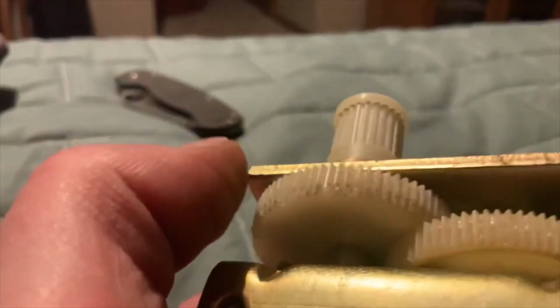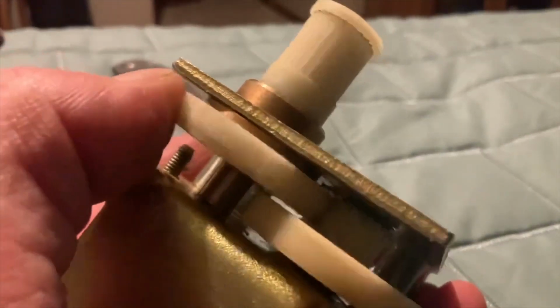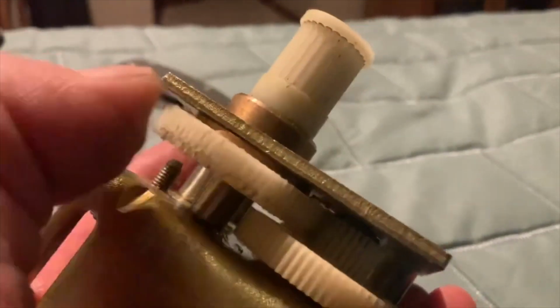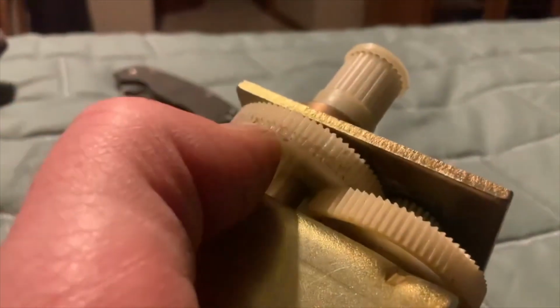And I just continued from one side to the other. They're like little V valleys. And now it turns, there's not even any grease on here. It turns really smoothly. I could barely turn it with 2 fingers before, or with my hand before. So that might have something to do with the fact that the motor wasn't spinning too easily. I'll work on it a little bit more, but that's crazy. This was melted.